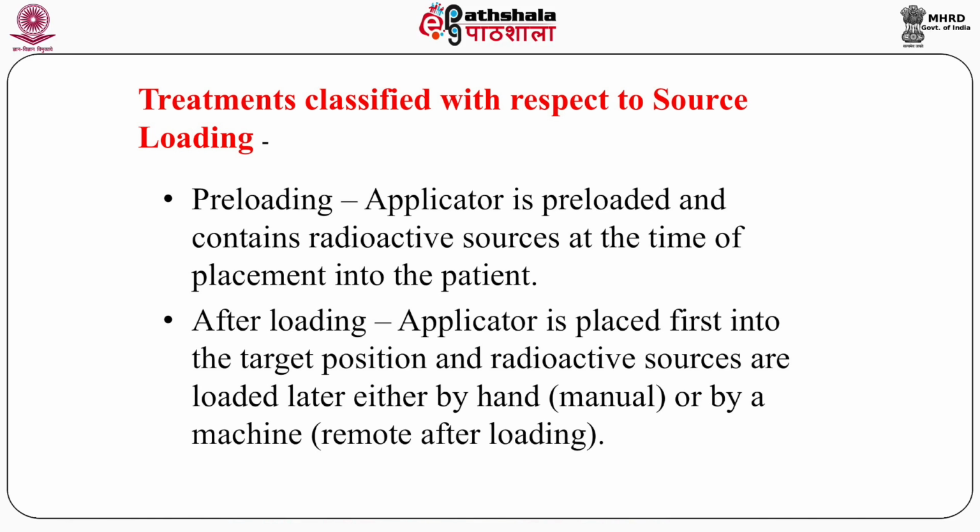Second is the afterloading system, where the applicator is placed first into the target position and the radioactive sources are loaded later, either by hand, called manual afterloading, or by a machine with the help of software, called remote afterloading.